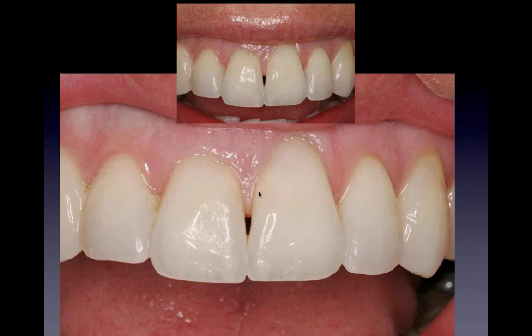Now, every now and then, I may get a little bit of a dip here or a little bit of a scratch when I'm polishing and I see the two layers coming together. If that happens, I just run a very fine red diamond burr there, re-etch, and put flowable and then polish the flowable. You're basically sealing, again, from the enamel to the composite. If you ever get that line coming back or if it's 5 years later and they get a stain, that's how I usually take away the stain. I use a rounded fine diamond burr to get the two pieces prepared, use etch again, use dentin bond, and use the flowable, and it really seals it nicely. But here we got a pretty good result with that cervical. So those are some fine repairs.